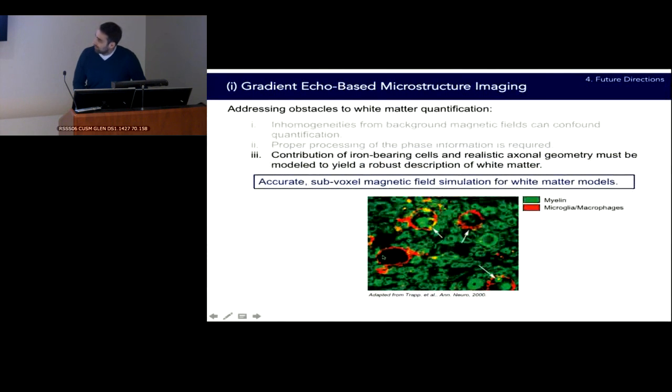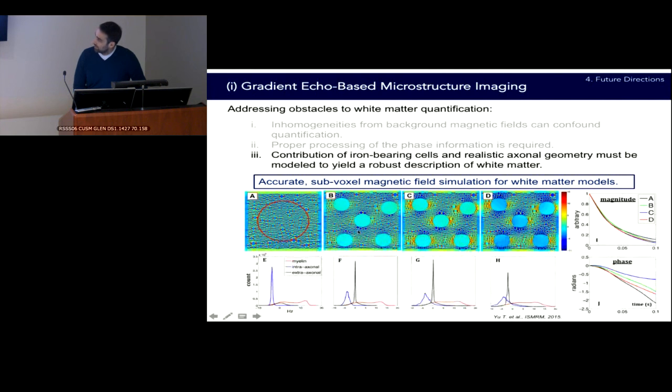What we'd ultimately like to be able to talk about is the extracellular space in MS, where there are microglia and macrophages which surround demyelinated lesions, but we know nothing about this based on MRI. We know nothing about what I'll call the extracellular environment. These phase and frequency sensitive techniques at high field MRI have been shown, if you model axons within a voxel which have a field shift, to produce different histograms for the intracellular, extracellular, and myelin water with different distributions of axons or different packing patterns. And this is very challenging.